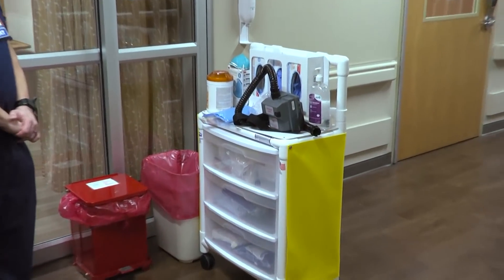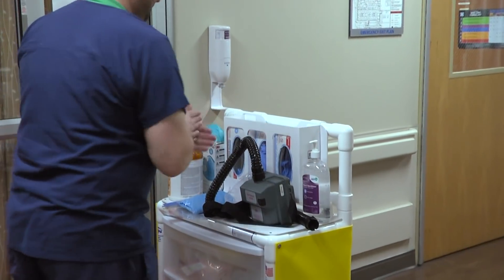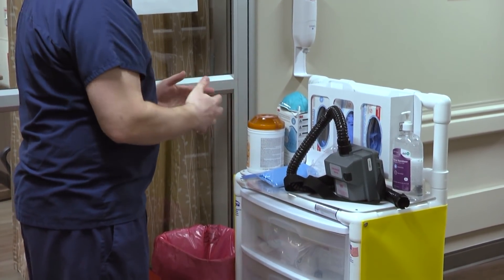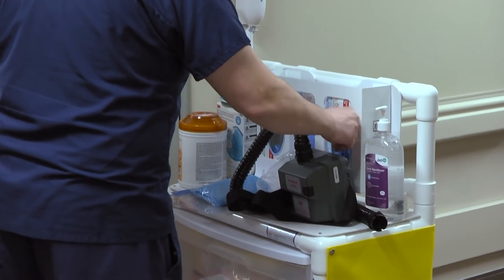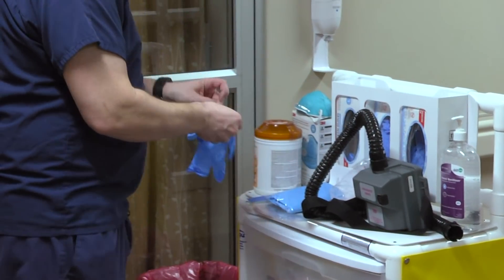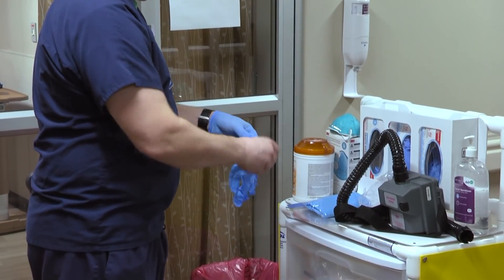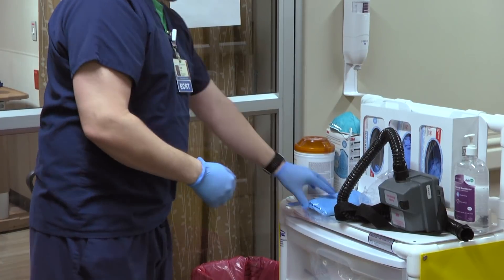Prepare to enter the room. Clean your hands. Put on gloves. Put on isolation gown.